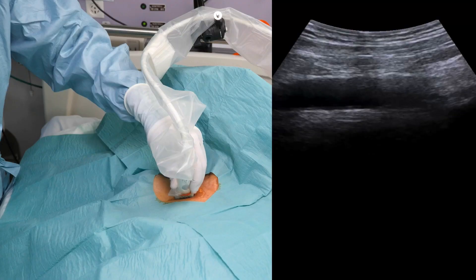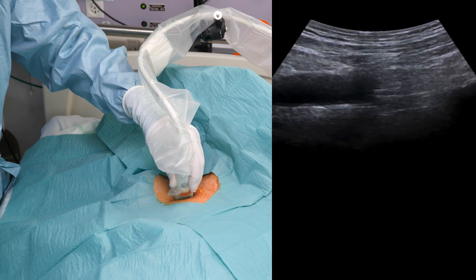If you're having difficulties finding the vein, follow these steps. First, it's usually easier to find the artery, so start there. Then slowly scan downwards and the vein should come into view closer to the probe.